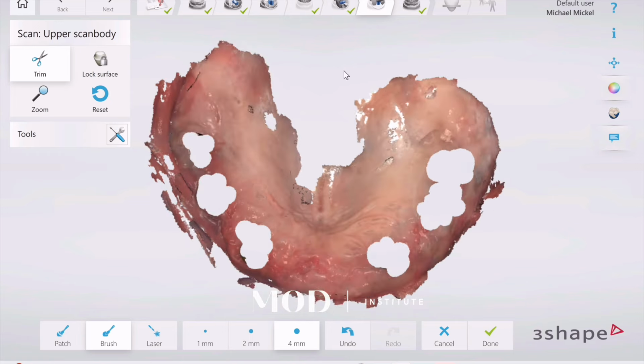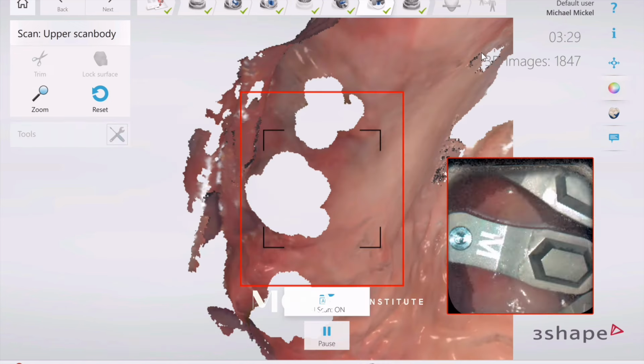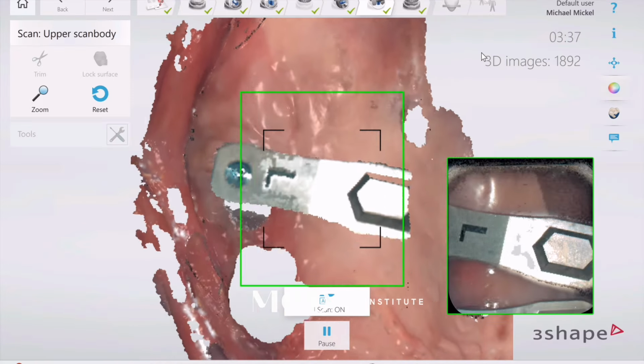So then I'm just deleting a little bit more of those caps. And again, on the lower, I'm deleting a little bit more of those caps so I don't have any interferences with my scan body scan. And now I'm going to go ahead and put my scan bodies in. And these are the diving board style. And this is real speed now.